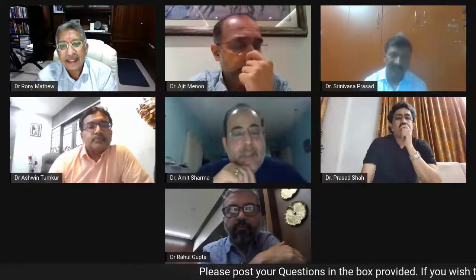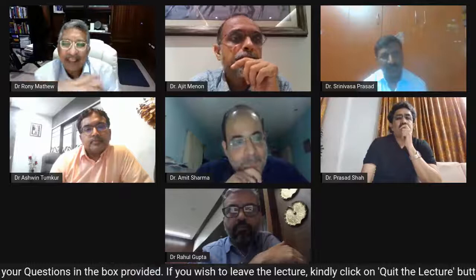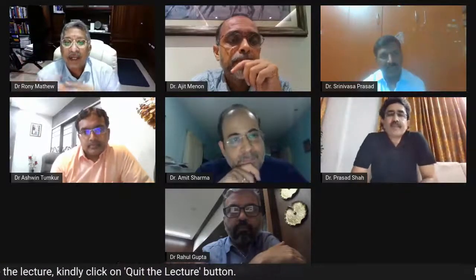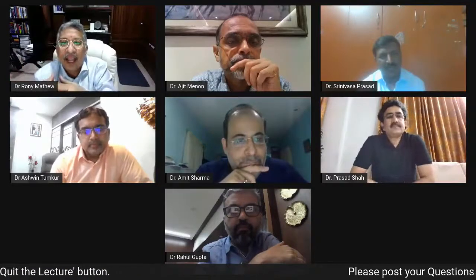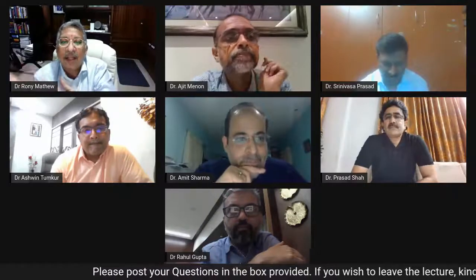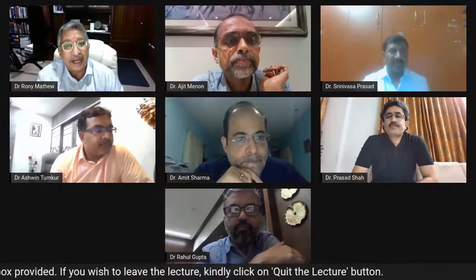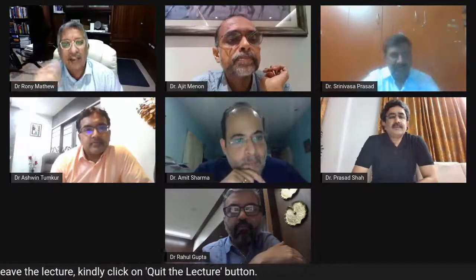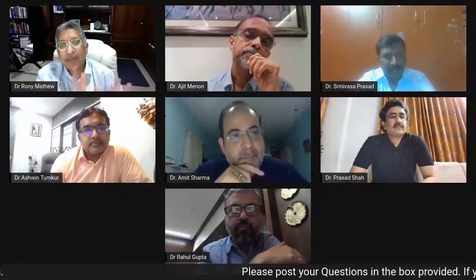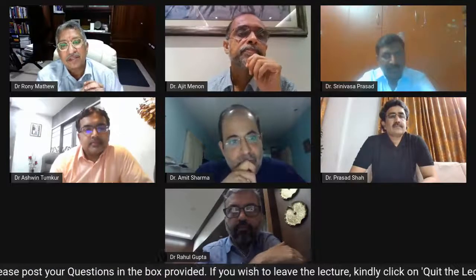Under-expansion, yes. At that point, I think it's primarily because there's probably eccentric calcium over there. You can see eccentric calcium on the OCT right now, because it is dilated. There was a dissection over there, and what you see is a dissected plaque there. So between the dissected plaque, there will be calcium that you can't see. But you can see the calcium once you do an OCT post-stent. If you really nudge it open, you will be able to nudge it open only with the circumflex secured. Without that, you cannot open that. You may cause a problem to the circumflex.